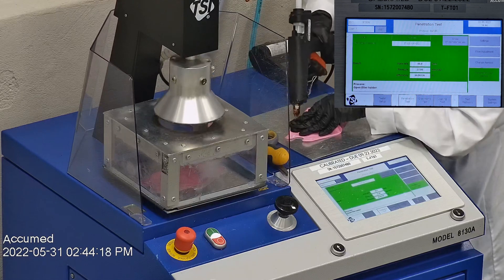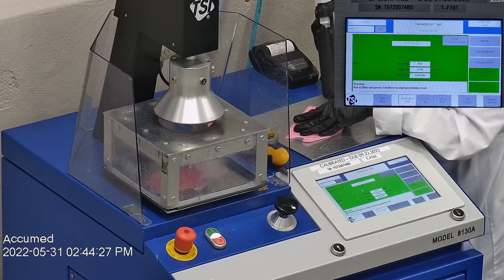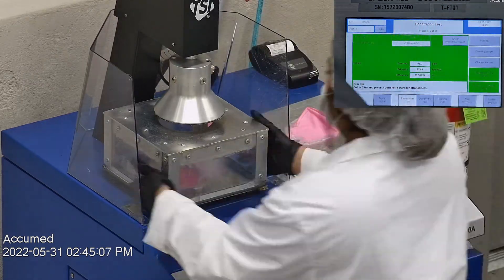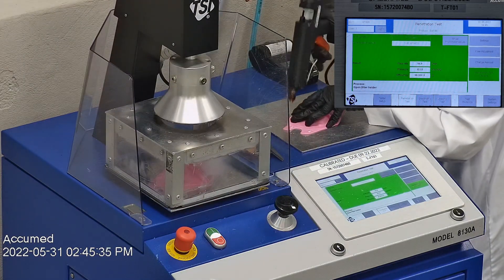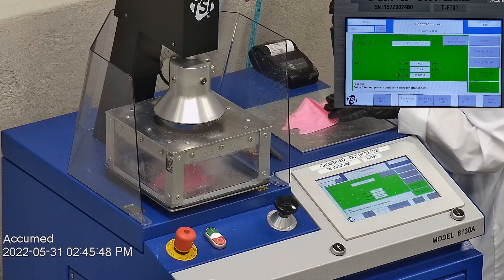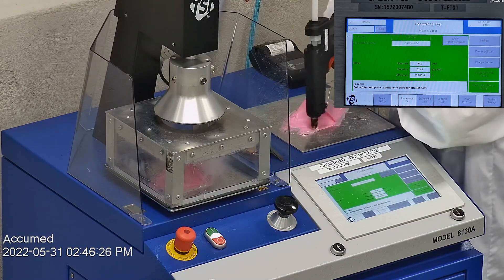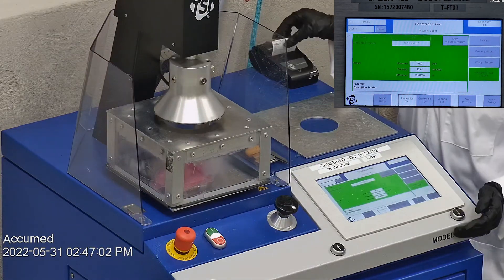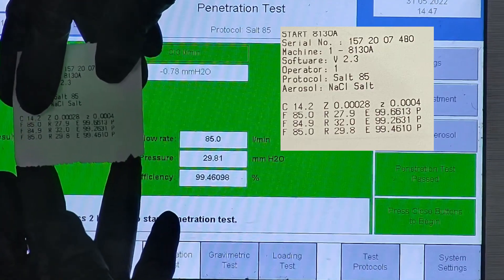The first sample tested at 99.66% filtration efficiency with a pressure drop of 27.9 millimeters of water. The second sample had a filtration percentage of 99.26% and a pressure drop of 32 millimeters of water. The last sample's filtration percentage was 99.46% with a pressure drop of 29.8 millimeters of water.